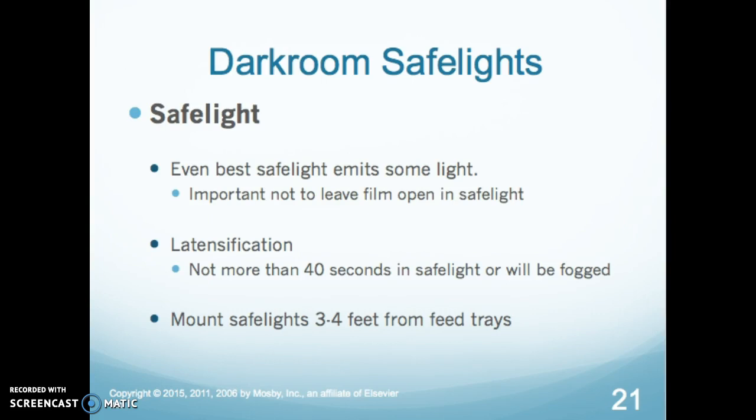So your latent image is safe for 40 seconds within the safe light, or you'll start to fog your film. So most safe lights are mounted 3 to 4 feet from the feeding tray of your processor.